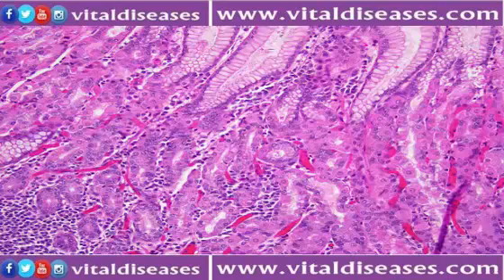The way that the mucosal cells are organized differs depending on what region of the stomach you are in. The cardia, nearest the gastroesophageal junction, has shallow gastric pits, which consist predominantly of mucus or foveolar cells. The mucosa of the fundus and body contain a mixture of mucus cells and parietal cells, and can be characterized as oxyntic mucosa. The antral mucosa then returns to being predominantly mucus cells.